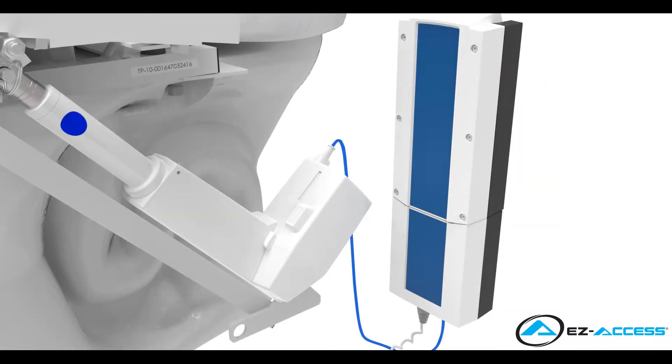Due to cord length, the battery and control box will need to be mounted within a 3 foot radius from the linear actuator, also known as the motor.